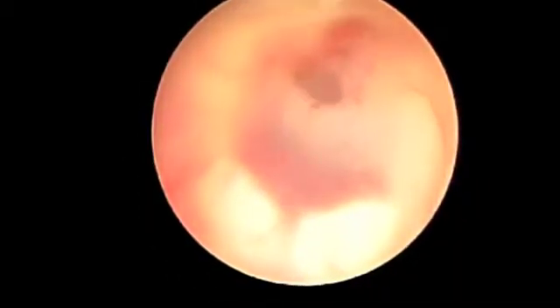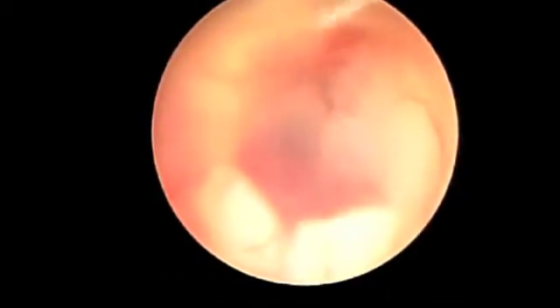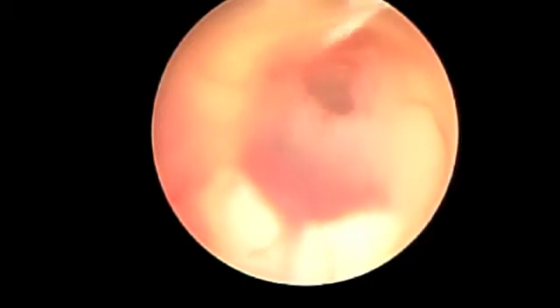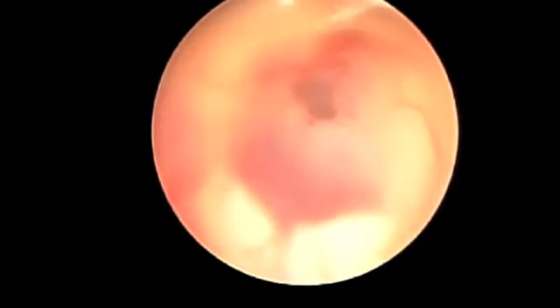Here, pulsations of the stoma between the third ventricle and cisterns demonstrate its patency, and the mammillary bodies can be seen at the bottom of the screen.